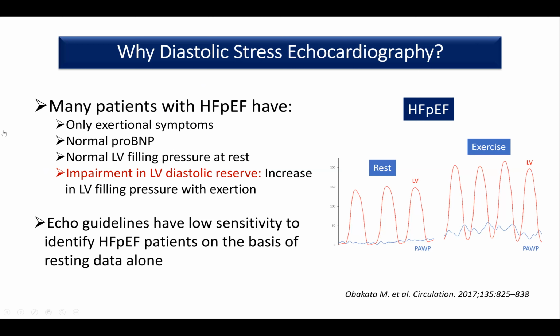That means the normal filling pressure at rest will increase with exertion. Let's look here on the right-hand side. This patient has heart failure with preserved ejection fraction. You can see at rest, this is wedge pressure in blue and LV pressure in red. At rest, wedge pressure is normal. Look what happened with exercise.